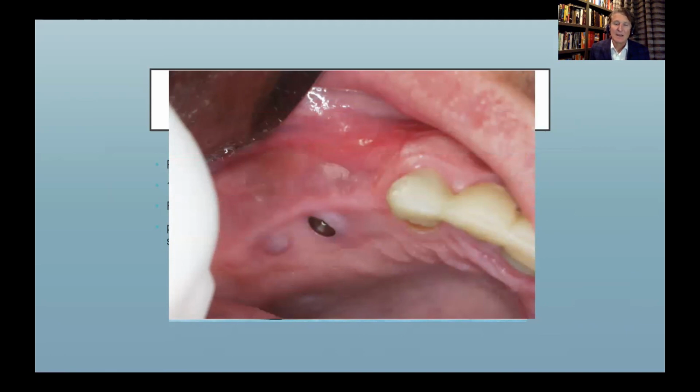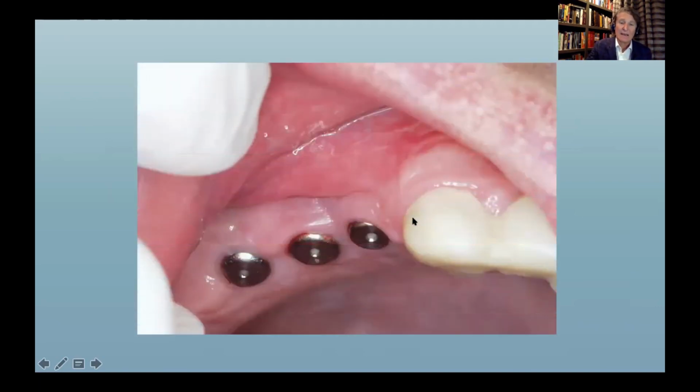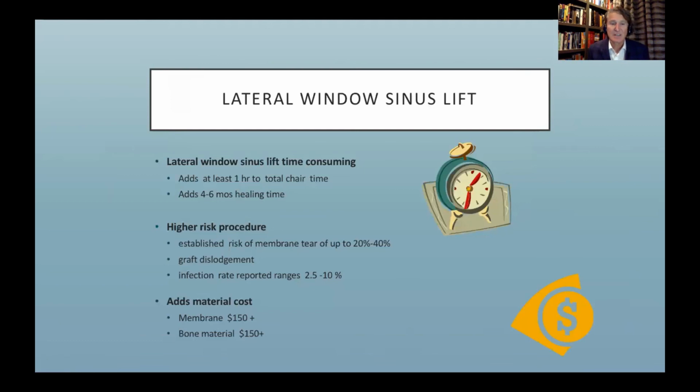And so, again, I would recommend anybody doing a lateral window procedure, look at your risk factors and look at your skill sets. But as I said with the previous study showing, even though there's complications, the implant survival rate was good. And so we were able to successfully finish the case.